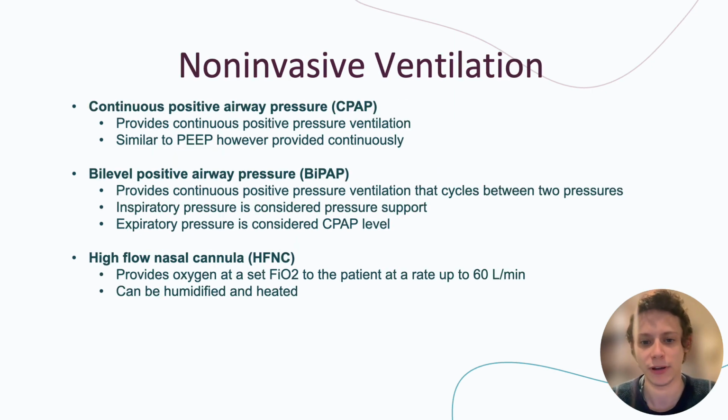So continuing the topic of extubation, once someone is typically extubated, they'll be placed on a non-invasive ventilation strategy. These 3 are the most common. First you have CPAP, which is continuous positive airway pressure. As the name sounds, it provides a continuous positive pressure ventilation. You can think of it very similar to PEEP. However, instead of being administered only during expiration as PEEP, it is being provided continuously.